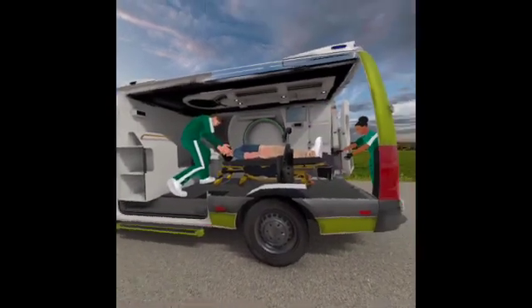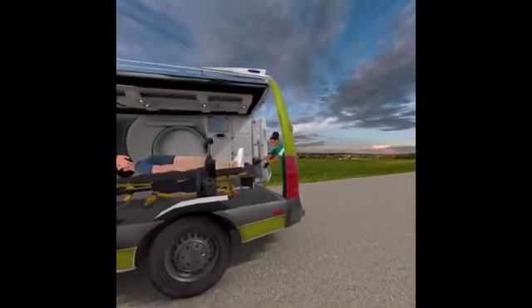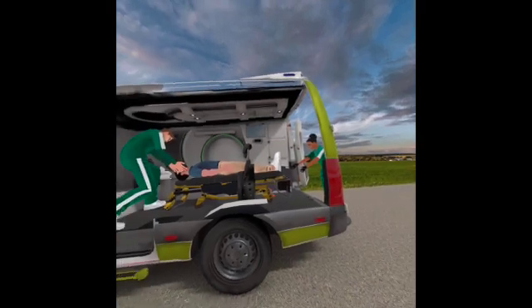The paramedics work together to remove the positioning aid device and stow it away in order to transport the patient to the hospital.